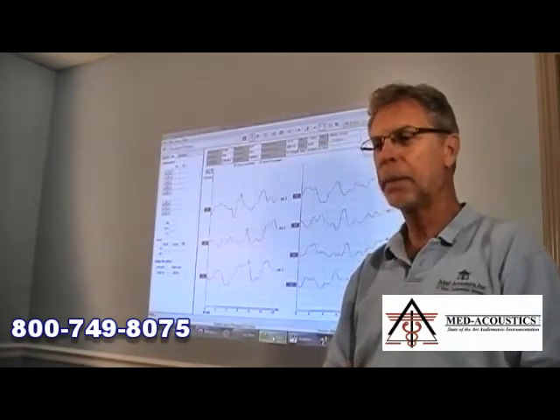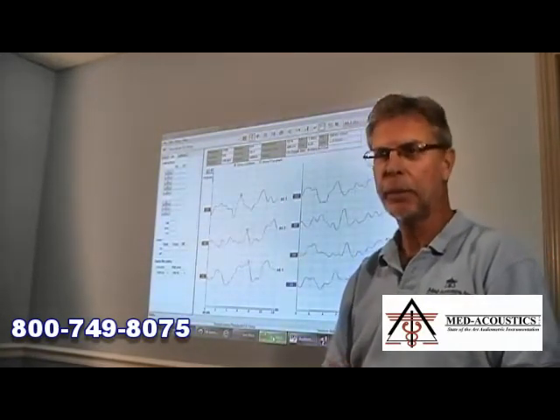And she couldn't move. I mean, this was the office, and wherever you went in the office was the same thing. If I tried to get further away from it, it wasn't far enough. So I thought, if anything will run in here, it's the Eclipse. And so I came back with that, and that ran without showing the radio station at all in any of the responses. And so we left that there.